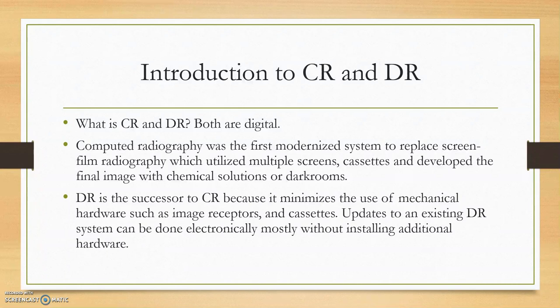So to introduce DR, moving on, it has many integrated features and even wireless functions to transmit data to the receiving computer. There is a great lack of mechanical parts, which is good. It causes a longer life of the machines due to an integrated system called a TFT that houses closer components, and it allows higher travel speeds for the digital information to move across. The final image in DR can be compensated in post-processing if the exposure brightness is too high, and then it can be formatted and sent out to the radiologists and anyone else more readily.